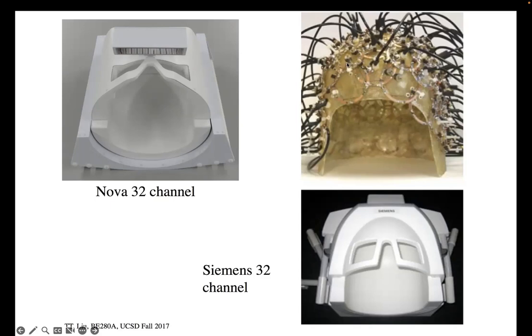When this coil has a current running in it, because your sample is causing that, you don't want the coil itself to excite the coil next to it, right? You'd rather overlap these things such that the mutual inductance gets canceled out. So there are some design considerations for how you place these coils around the patient. As you can see, there are 32 coils here placed around the patient's brain, and this is called a phased array coil.